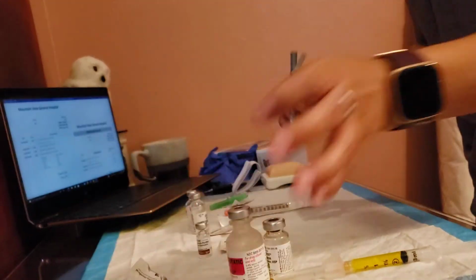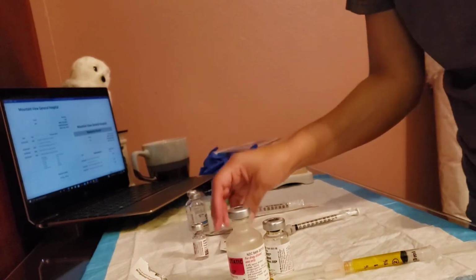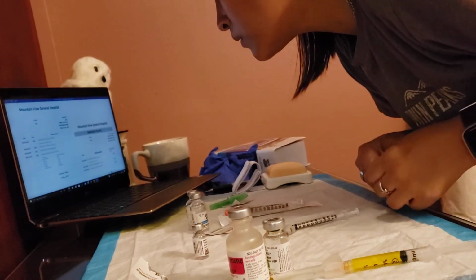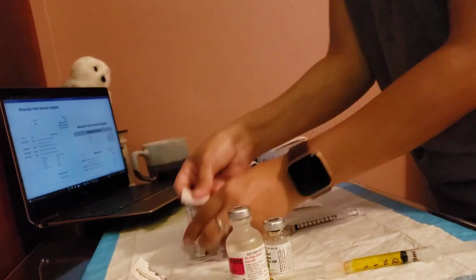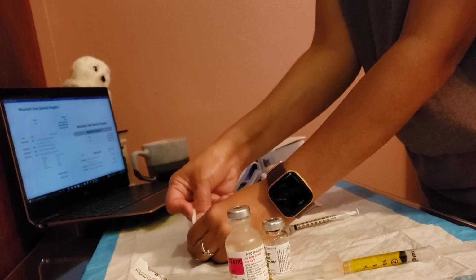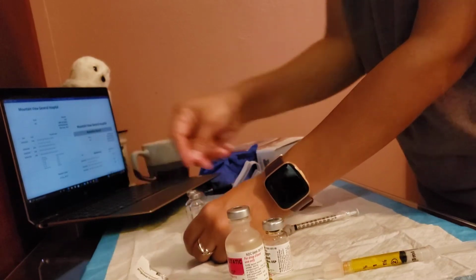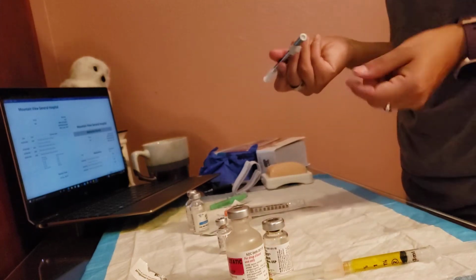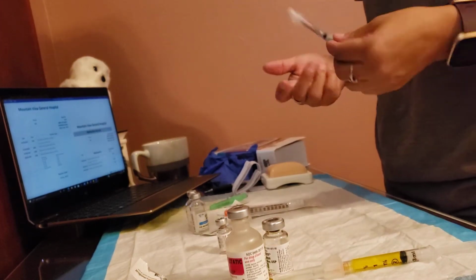All right, so now I have my TB needle, my PPD, and I just need 0.1 ml. So I'm going to clean my vial, and I'm going to inject it and stick my patient with the same needle because it's just one.